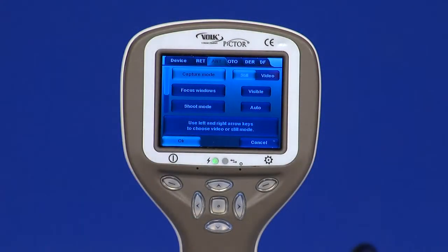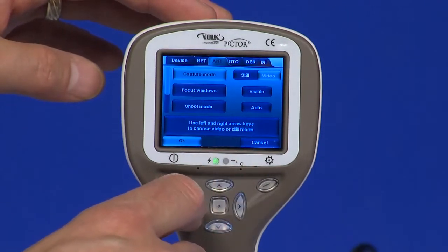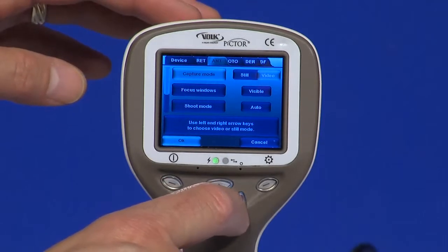Let's go through the menu options. Capture mode: both still images and video can be taken. When taking video, the shutter button must be held down. The video recording will stop once the shutter button is released.